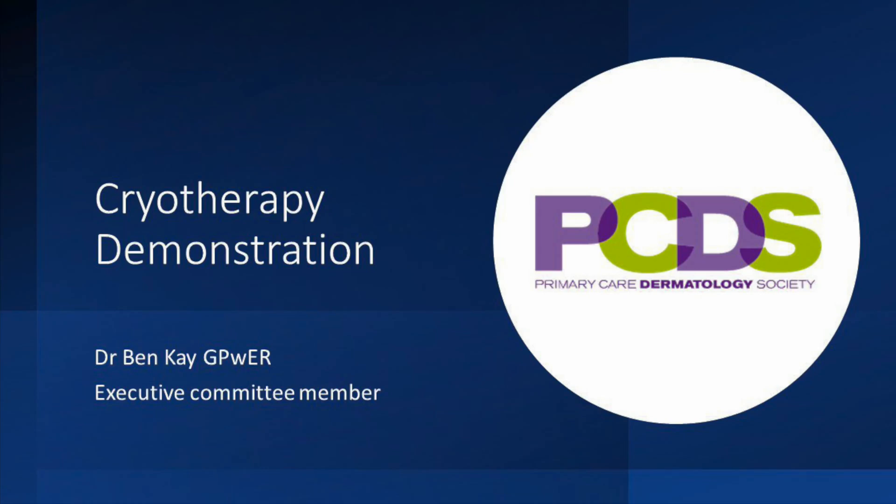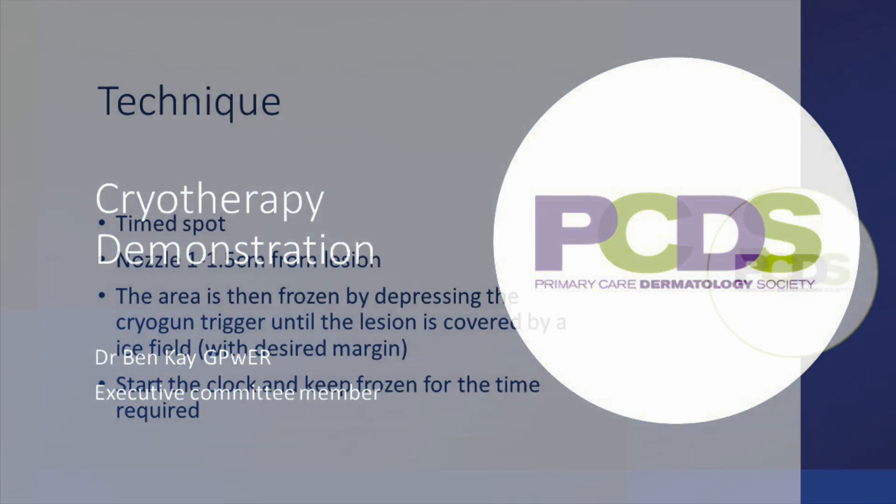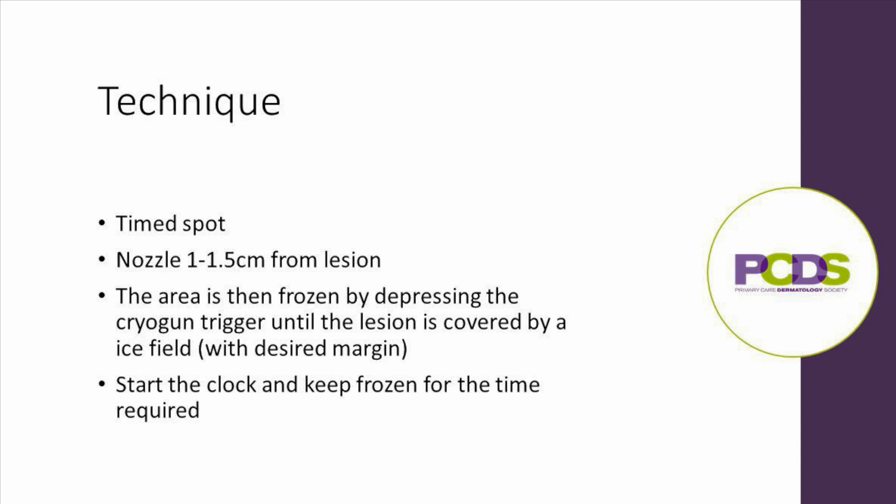Hello, my name's Ben Kay and I'm a GP working with the PCDS. This is a short demonstration on cryotherapy. The technique we advise is the time spot method with liquid nitrogen in a cryogun, as this is the most consistent and will give you reproducible results.